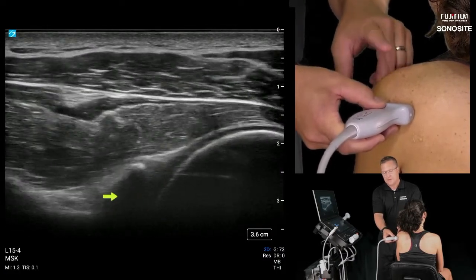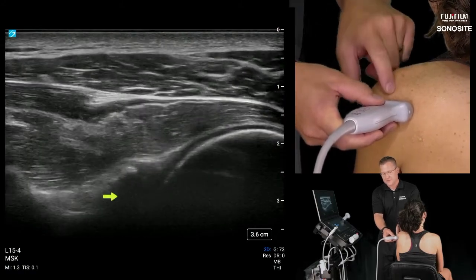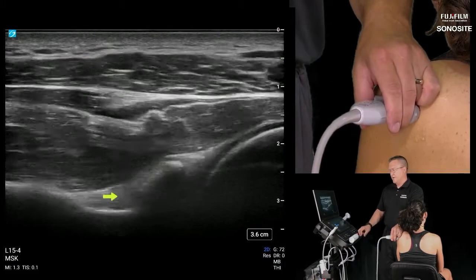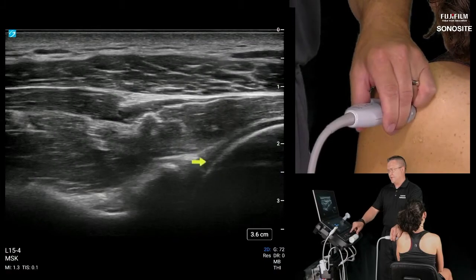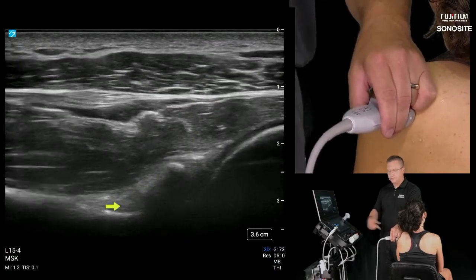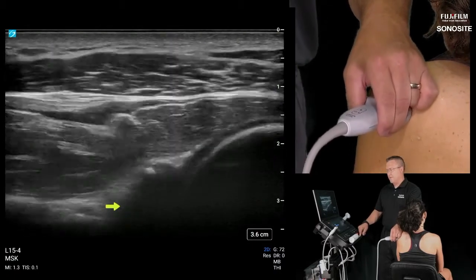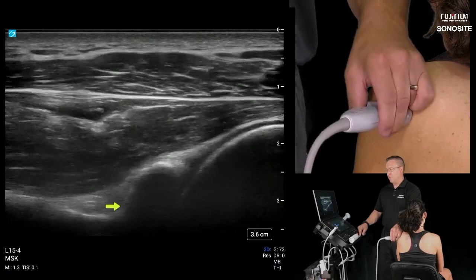It may be that this is a superior labral tear that has dumped its cyst down this notch, so that cyst can just pool down there, instead of it being something that you see originating from this part of the labrum. So if you do see a cyst there but you can't find the tail, obviously you're going to need to have an MRI anyways to see the extent of the labral tear, but that is what you should be aware of also.